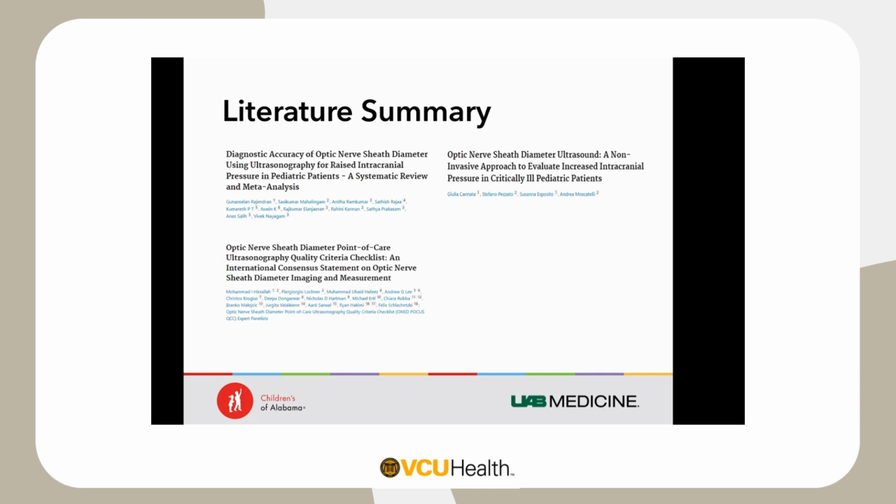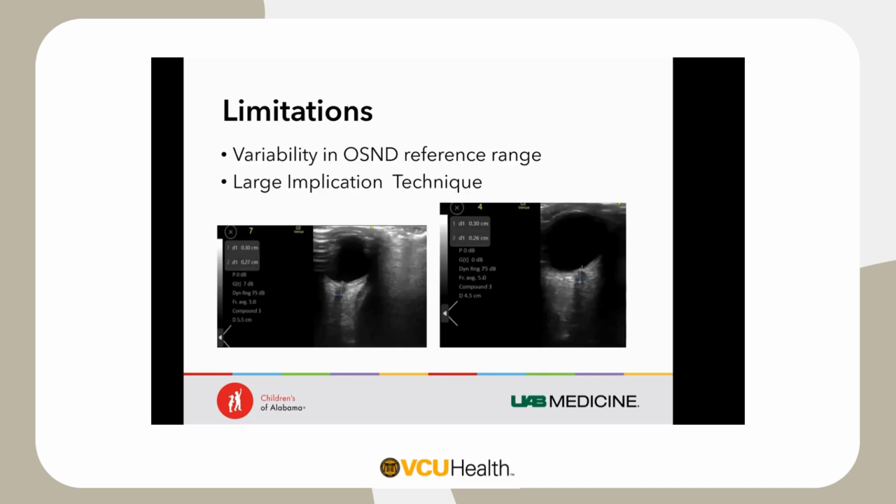There is a nice consensus for the adult world that really talks about how to get the imaging, the equipment, all of those, which a lot of that does transition to the pediatric world. It is where our cutoffs are, and that's kind of where we land.